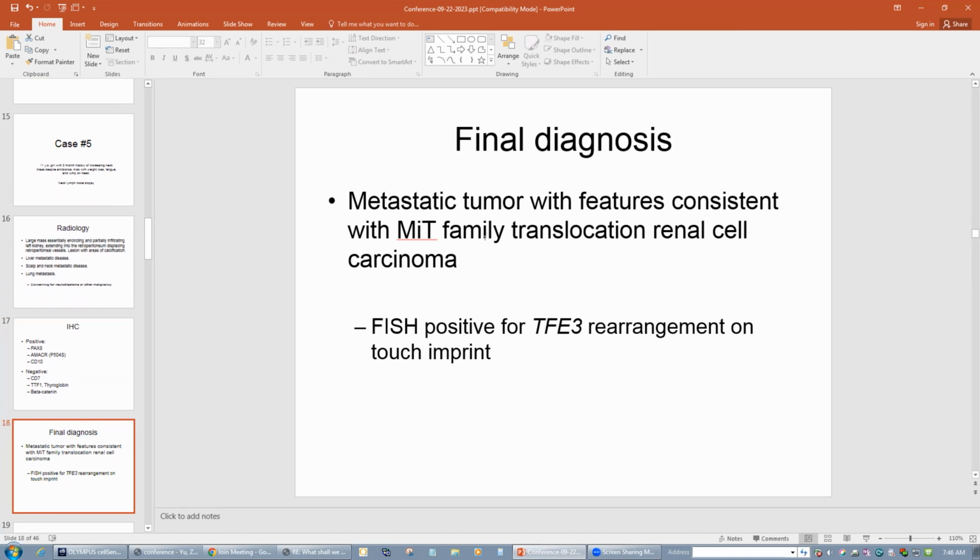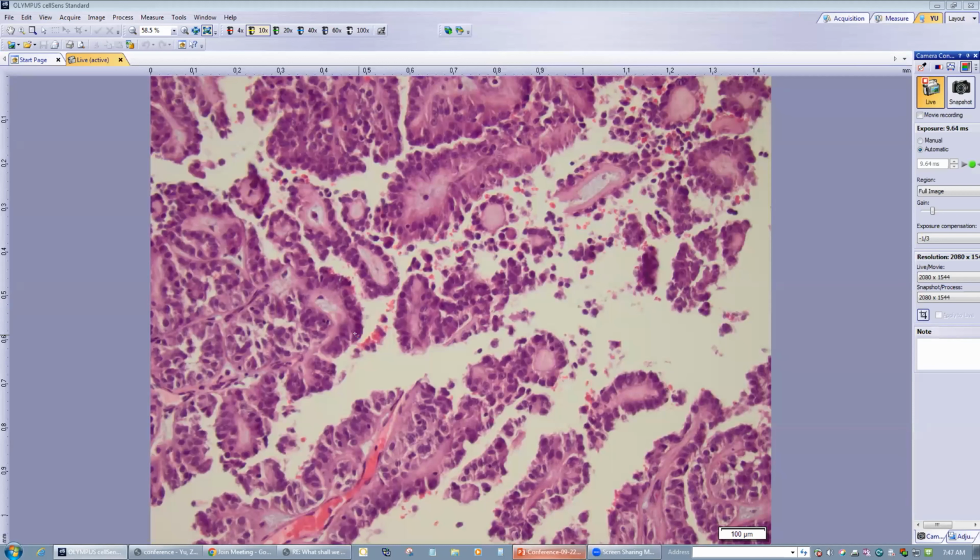So classic features in the kidney can help, though sometimes it's difficult, like metastasis, especially when the radiologists suggest the tumor is more outside, not inside, though probably still inside. But I did not follow up the patient after treatment. I don't think we had the renal resection, or we lost the follow-up. I don't remember this case. But just think that those kinds of tumors can have unusual morphology. You just think about putting together the differential, do some immunos, and remember the TFE3 or TFEB rearrangement test is helpful.